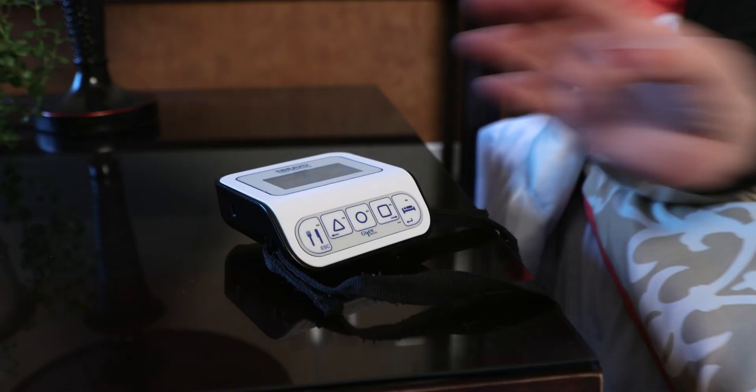This button should be pressed when you sleep, lie down, or recline, and pressed again when you rise.